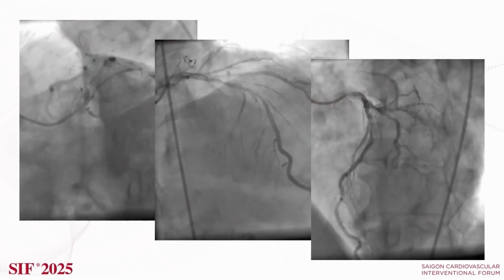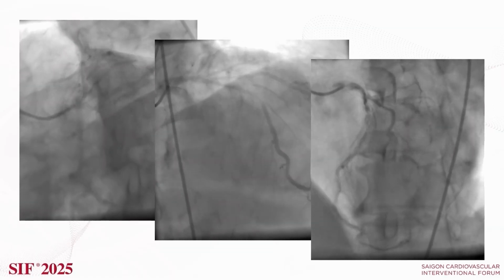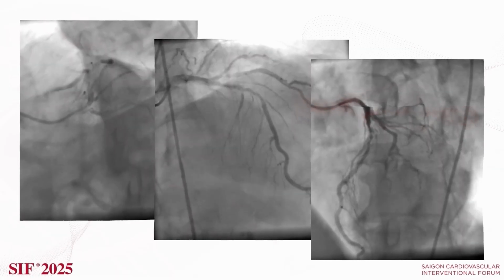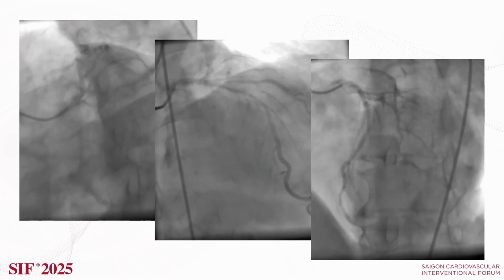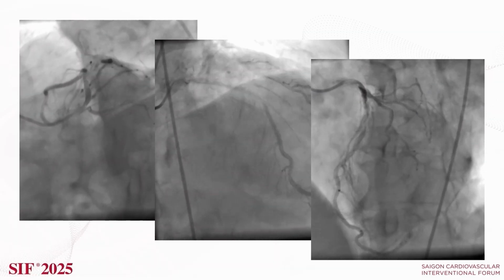So it's not only that we're talking about left main calcified LAD, but potentially also bifurcation issues at the LCx. I can't see it very clearly here, but one of my priorities would be to evaluate the circumflex to see what's going on at the ostium there. Of course, in addition to doing imaging on the LAD and left main.